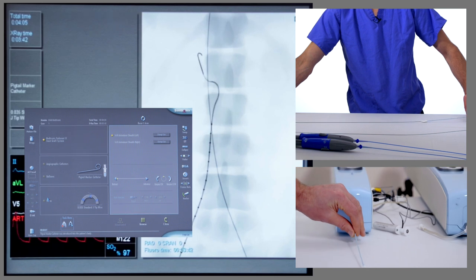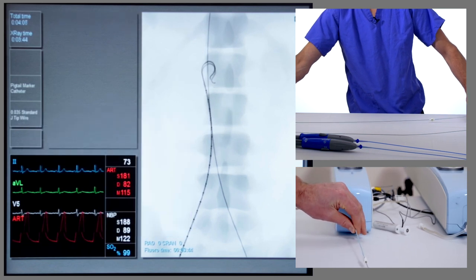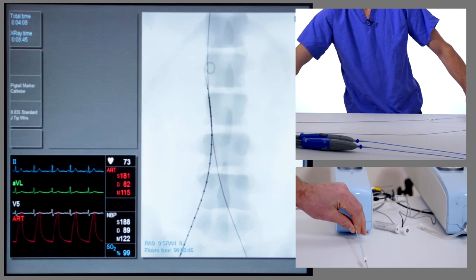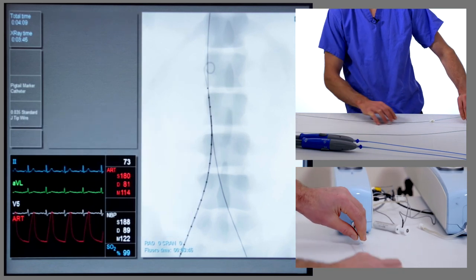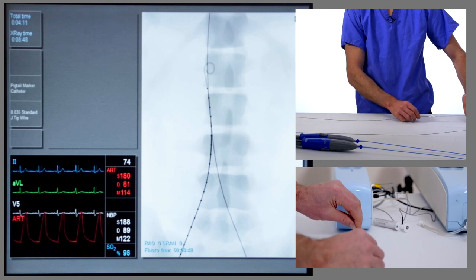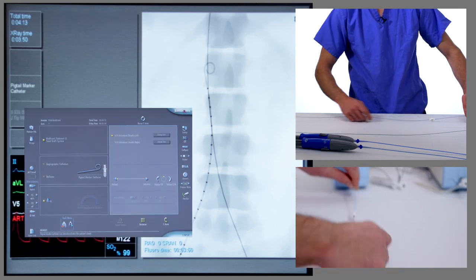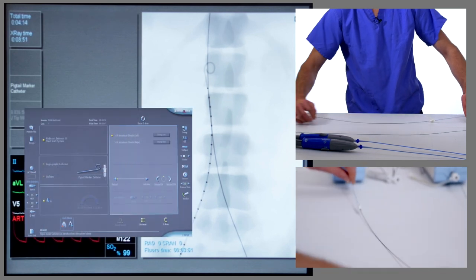We'll place the curl of the pigtail just above the renal arteries — the renal arteries are typically at the L1-2 disc space — and remove the J-tip wire.